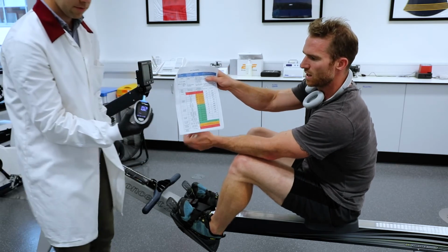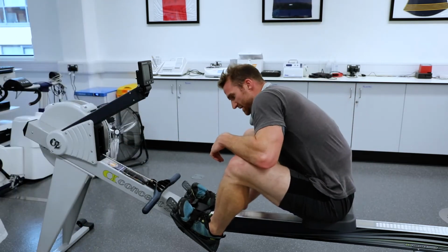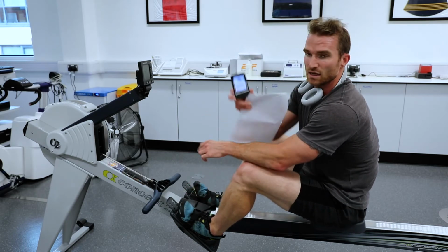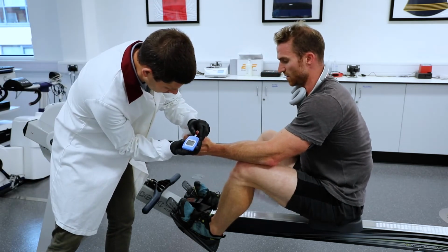Seven and trending down should be 18 grams of glucose, which is 6 dextrose tablets. So 5.6, you can see the discrepancy there. When the glucose is trending down, that's at 7. 7 and down, it's 5.6 on the actual thing there.